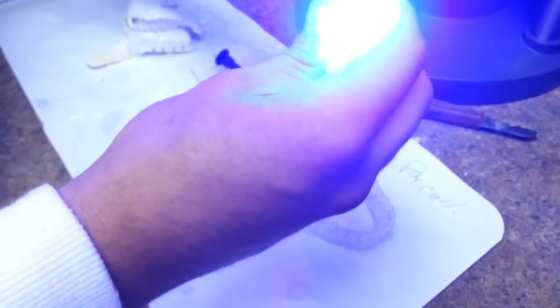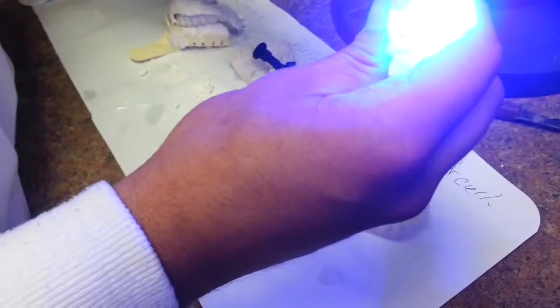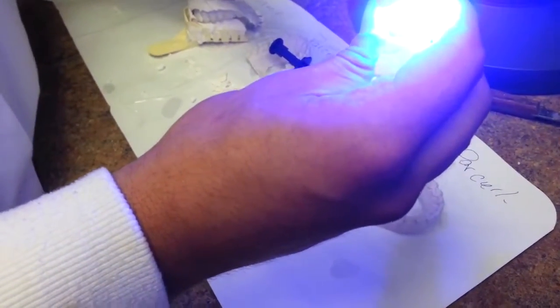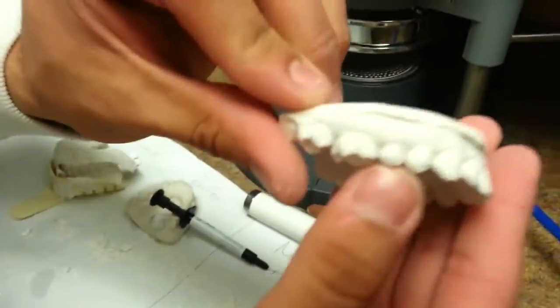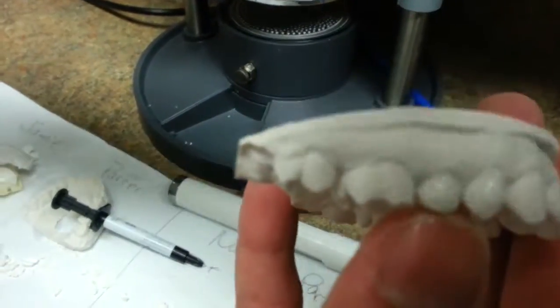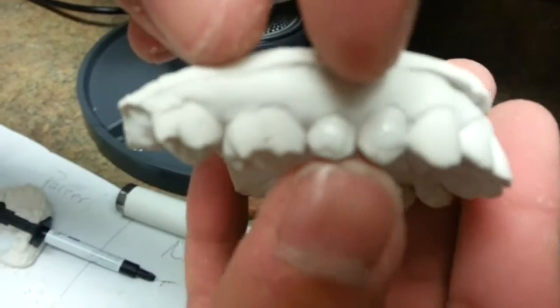Again, I'm gonna light this up. You light it for 10 seconds. I usually like to do two teeth at a time, and so that's it. Again, it's gonna look like this. Okay, it's gonna look like that right there.